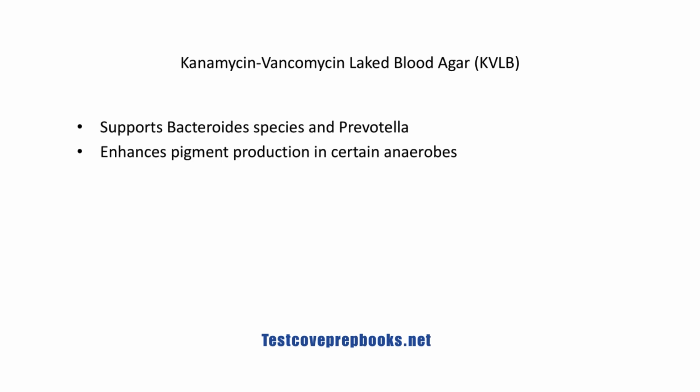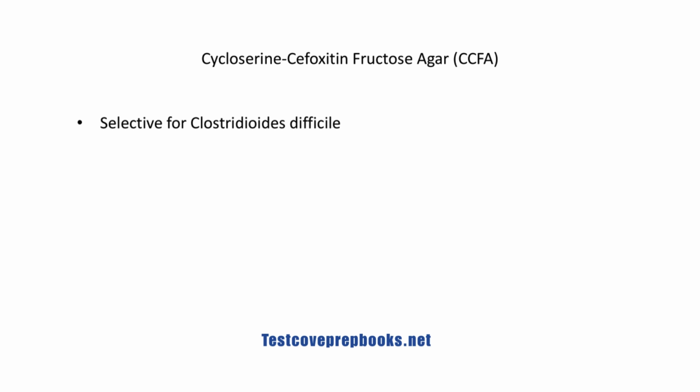Kanamycin-vancomycin-laked blood agar, or KVLB, supports the growth of Bacteroides species and Prevotella. This medium also enhances pigment production, which is an important feature for identifying certain anaerobes. Cycloserine cefoxitin fructose agar, or CCFA, is highly selective for Clostridioides difficile, the organism associated with antibiotic-associated colitis.